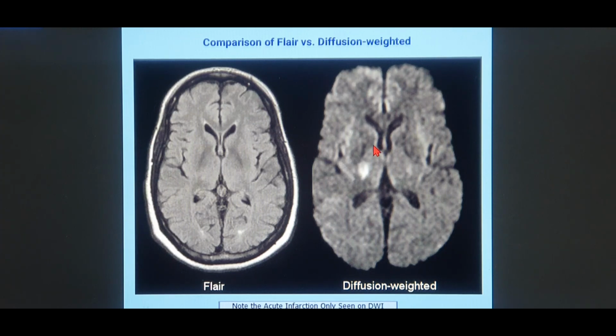So what happens is that if there's a tumor in the PNS, that's any nose or sinus or brain, intracranial, a malignant tumor, the place where the tumor exactly is will be very low on water. The H2O, the water level in that tumor will be very low as compared to the normal tissues surrounding it. So the cellularity, the water level in the tumor is going to be very low. And if the water in that particular area is low, the diffusion in that region is also going to be restricted.